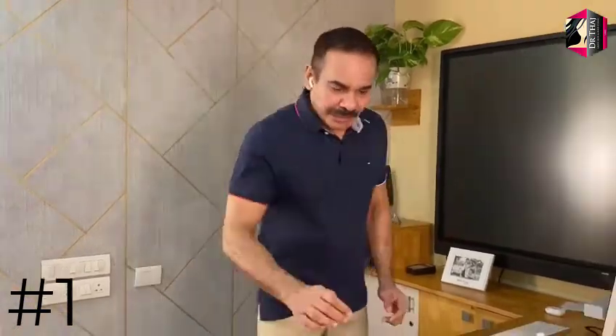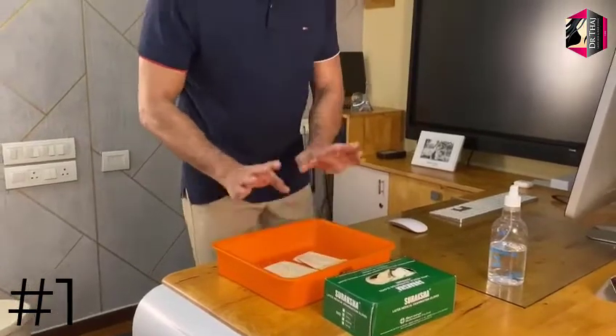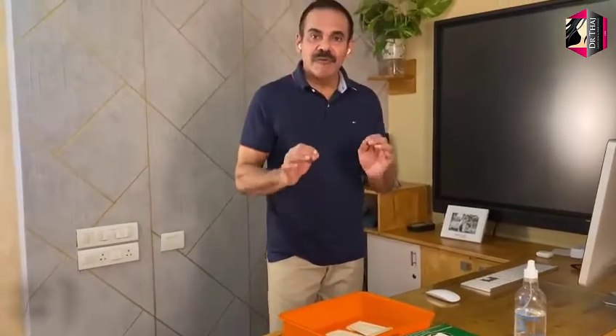The first thing you have to do is select the gloves which are of your size. Take out the gloves and put them on a clean surface — that is sterile, meaning germ-free.